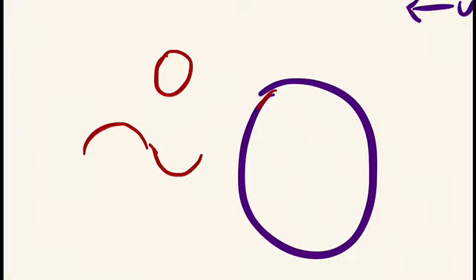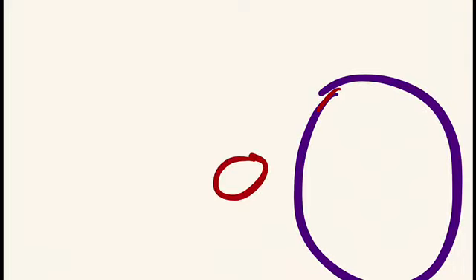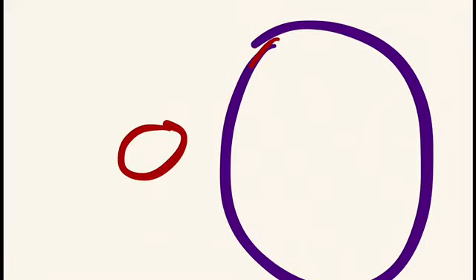The resultant vector, you can say why this resultant vector is here, because if I actually look at the location of V1, it should be here, okay. Now this right atrial depolarization vector is like this.